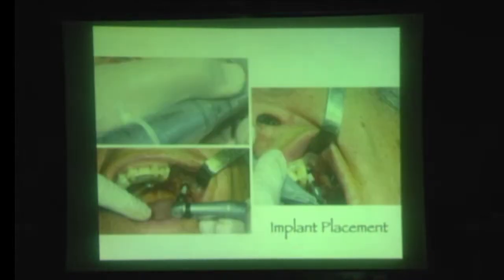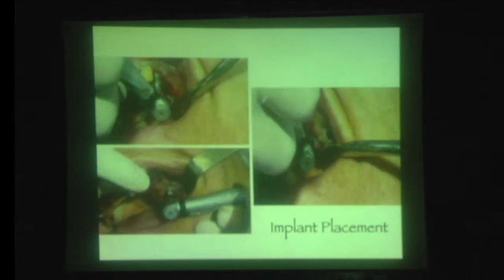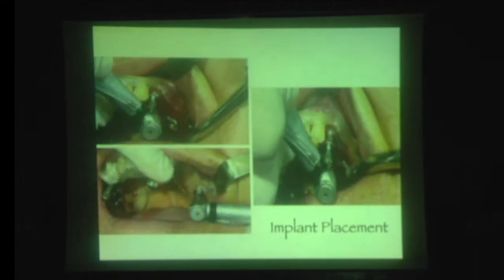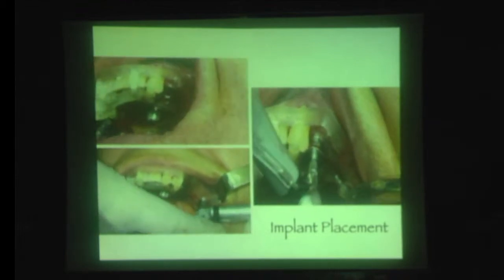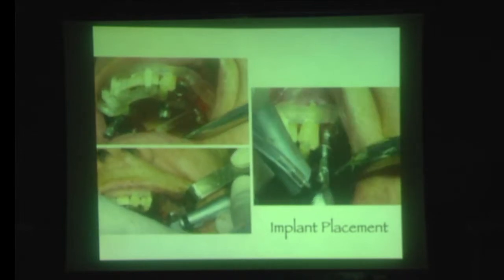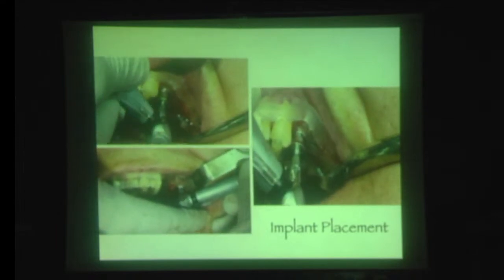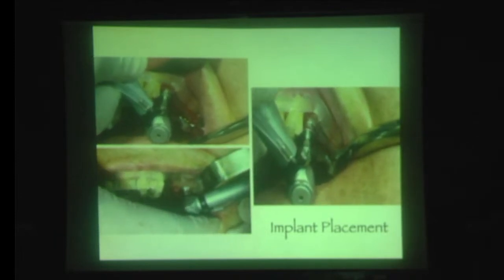Look, so watch me just saying bye-bye to the posterior wall of the sinus, and I will show you later. And you can close your eyes. Don't close, but you can close your eyes. Because if you close or not, the guide will do everything. Okay? The most important thing, before the sleeve, don't start the engine. Just be in the sleeve. After being in the sleeve, please start the engine and use the handpiece.